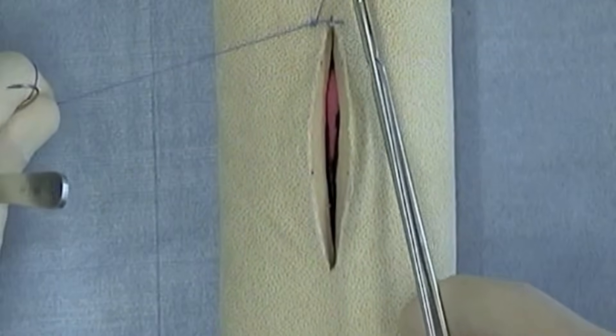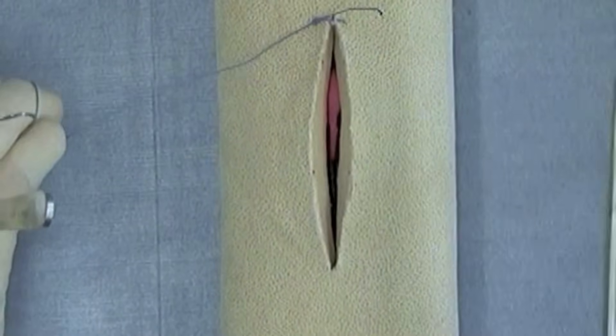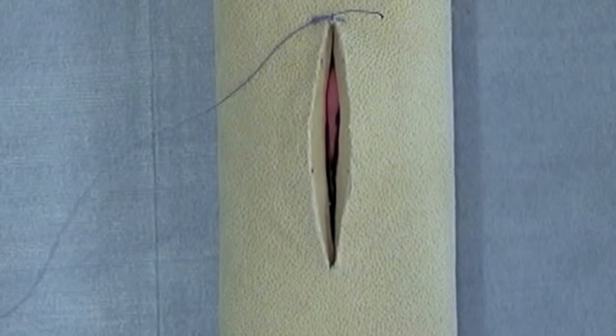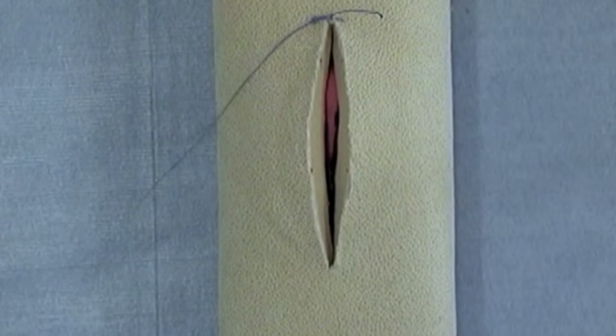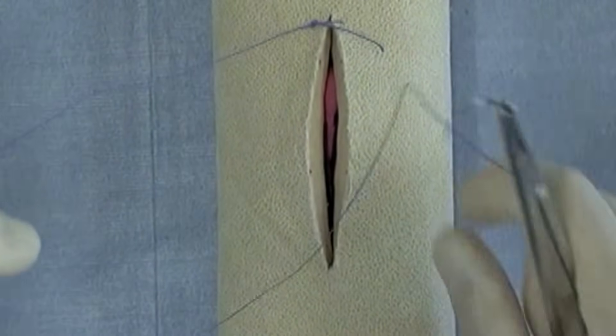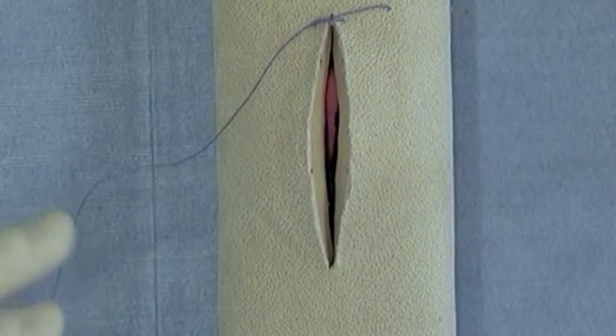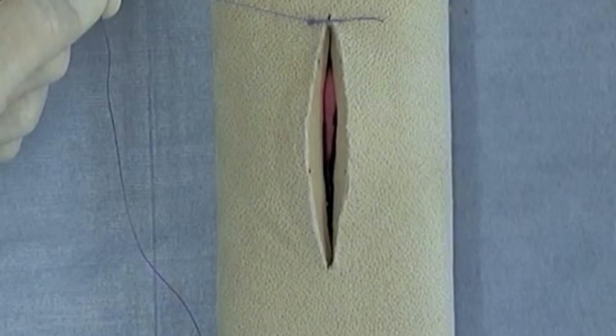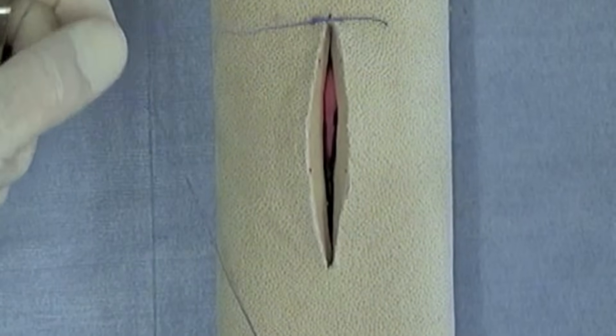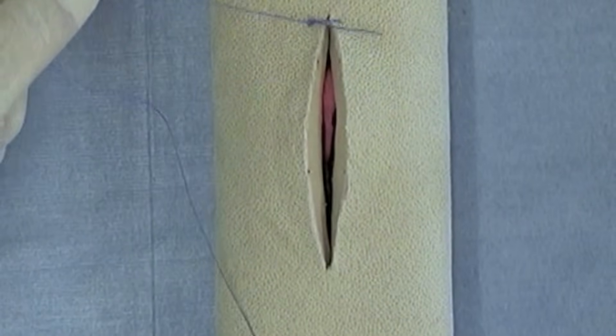Now obviously I'm just putting one square knot to complete this simple interrupted suture. Now you can do this forward interlocking pattern alone. It's much easier to do with an assistant to maintain tension on the residual suture here, and so I'm going to use an assistant here just for demonstration purposes.